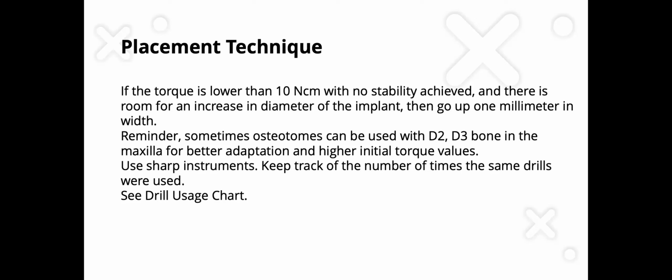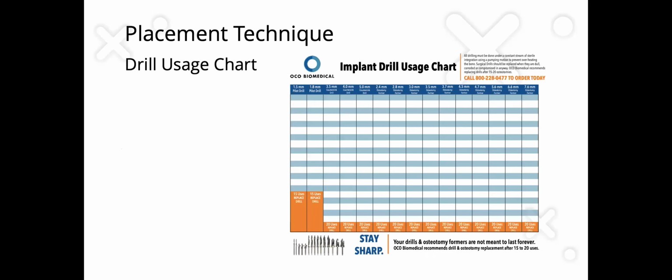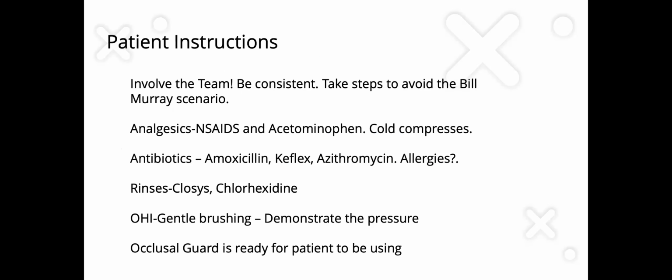Use sharp instruments. Keep track of the number of times the same drills were used. And so we created a drill usage chart for everyone to keep track of their drills in use, and have your teams all play a role with this. So before they go and sterilize, they're going to mark off the drills that were used.